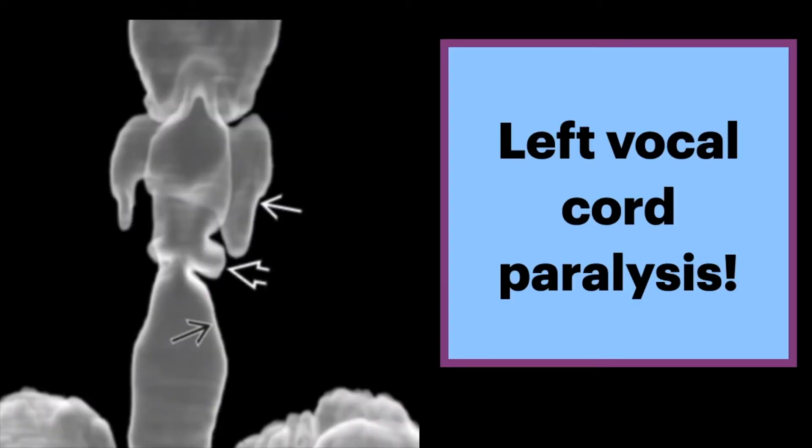Here is an anteroposterior 3D volume rendering of the airway. The straight arrow shows an enlarged piriform sinus, the open arrow shows an enlarged laryngeal ventricle, and the straight dark arrow shows flattening of the subglottic arch.